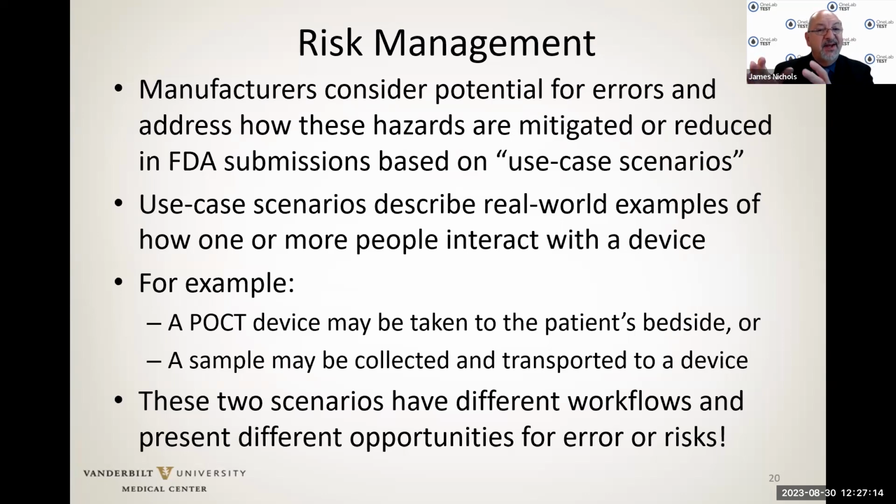Or we can keep that glucose meter stationary in a spare unit on the nursing unit, say maybe a utility closet, and we can go out to the patient, collect a specimen, and bring the specimen to that device. These are two different use case scenarios that have different risks involved.